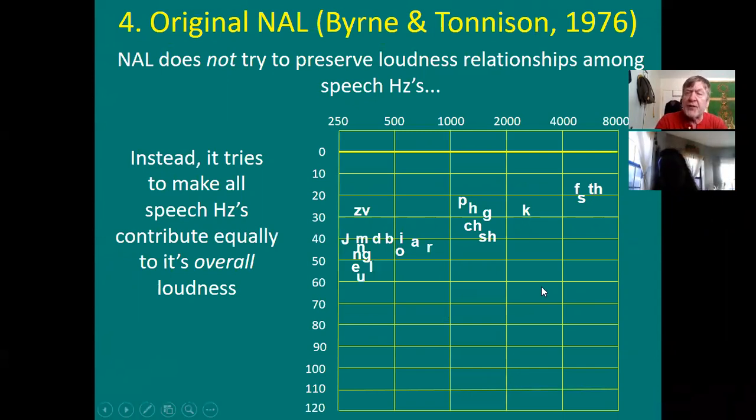Look at the speech relationships of the letters here on the audiogram. You've all heard this from me before in acoustics and from other instructors, I'm sure. Vowels and any letter that uses the voice. So look at here where I'm circling. Z, v, j, m, d, b, n.